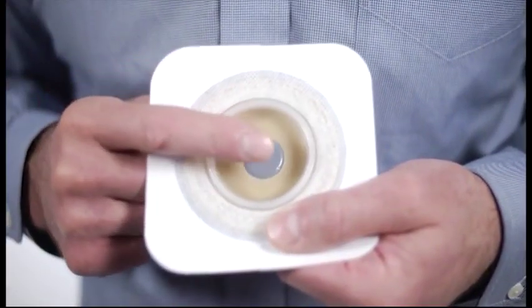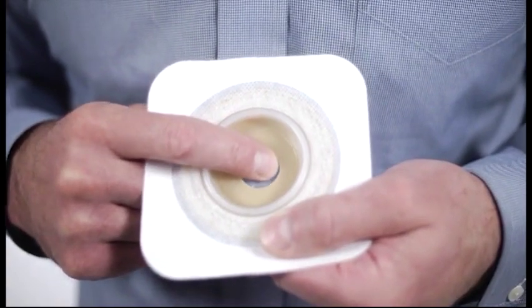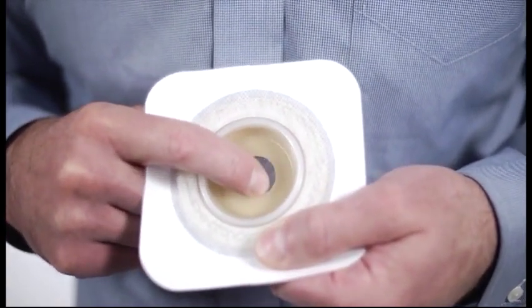If you are using a convex wafer, you will first need to depress the center of the shield before rolling the adhesive.